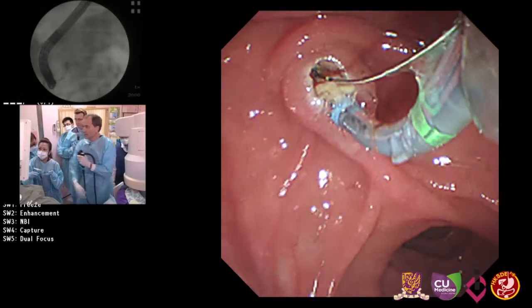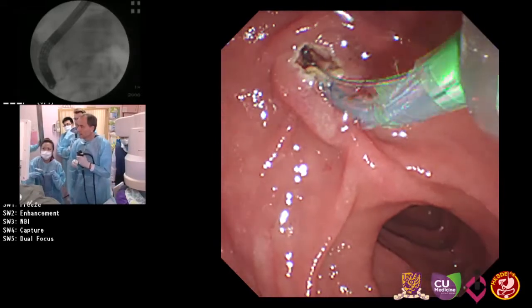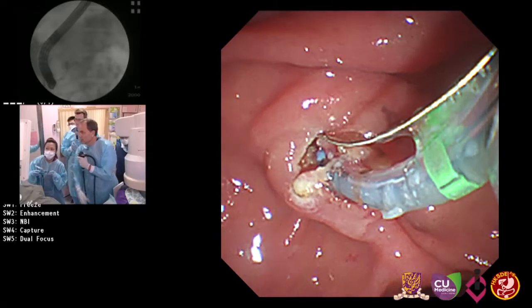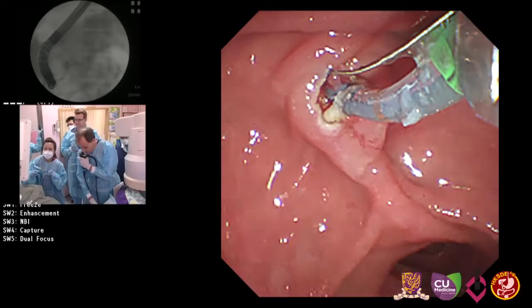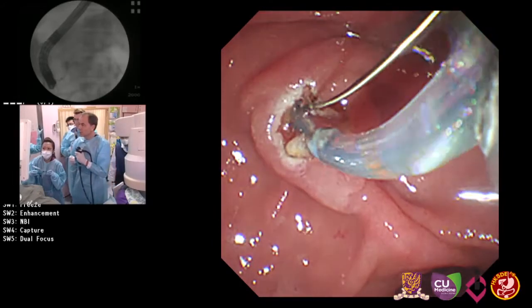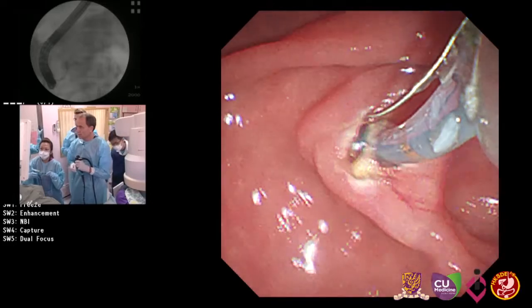And we can now nicely look into the duct. So pancreatic sphincterotomy is very susceptible to late stenosis. So that's why we use a cutting current as opposed to biliary. Okay. And now to avoid cutting too far, you can control millimeter by millimeter, just with small steps. So this should be already enough. So please relax.